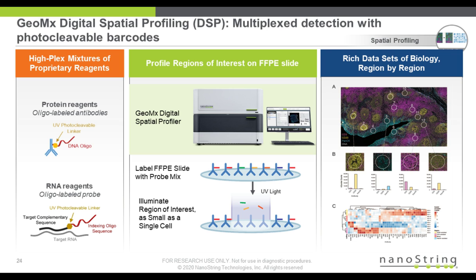If you think about what microscopes do for a living, they shine light in small places. So what this allowed us to do is literally go onto an FFPE tissue slice, you can see on the right-hand side of the screen here, and we can light it up with 4 colors in a microscope. That's what microscopes do very well.